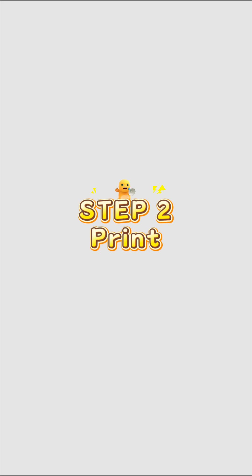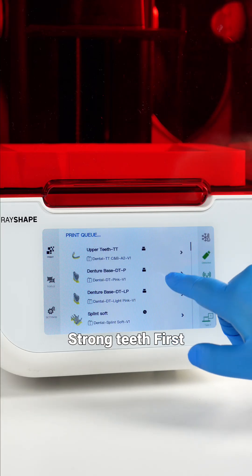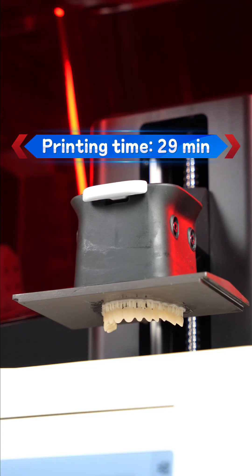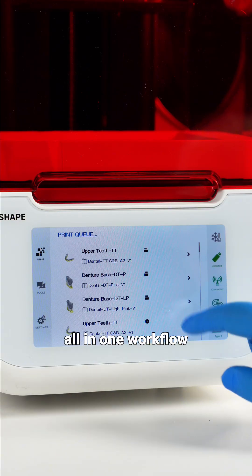Step 2: Print. Two specialized resins, one compact 3D printer. Strong teeth first, then a comfortable base — all-in-one workflow.